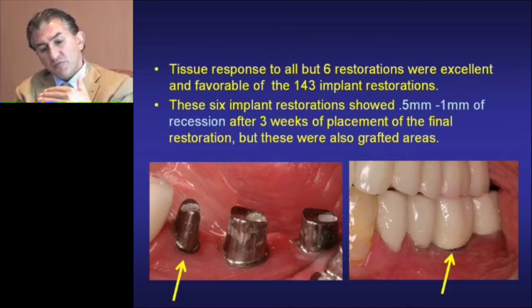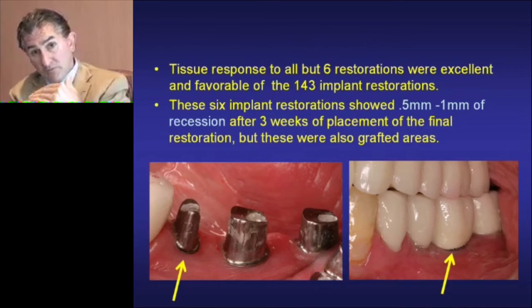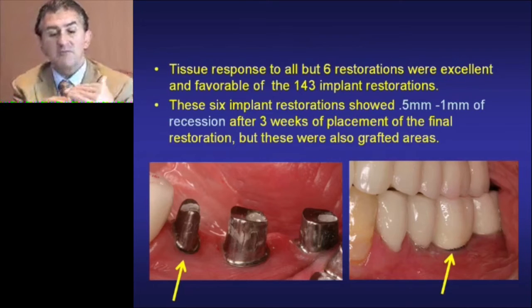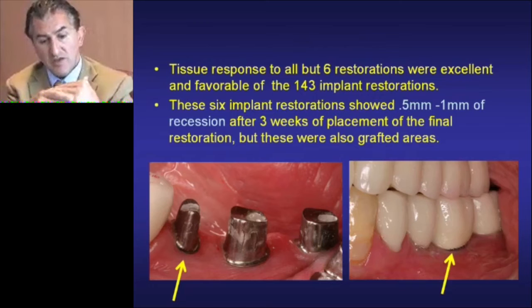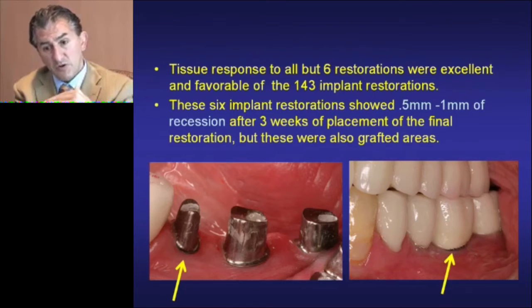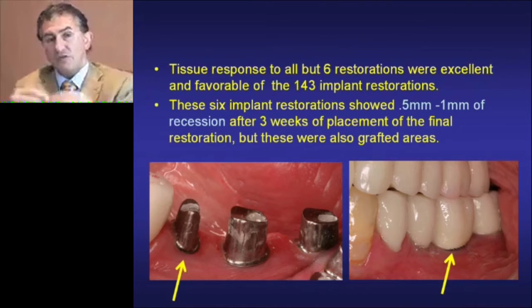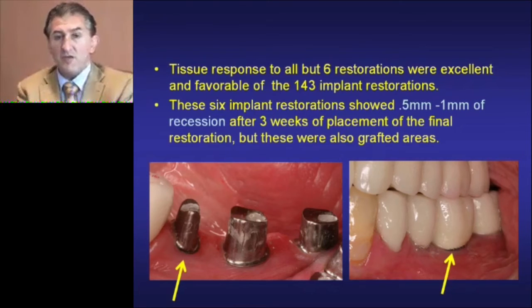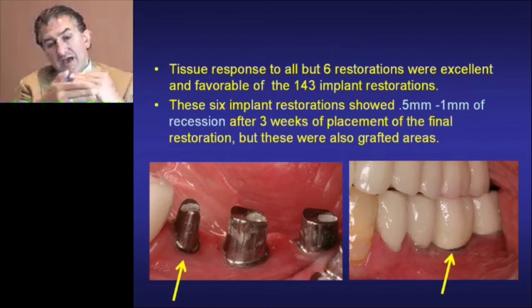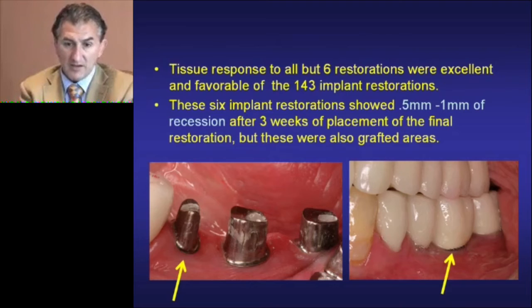Another problem was we were not asking the laboratory to make the abutment at 1 millimeter below the tissue. We were asking them to make it at the tissue. That conversely led to when we placed the abutment, the tissue would roll over and we started getting the recession in the black line. Once we realized we had to specifically say 1 millimeter below the tissue, as the tissue was pushed, there was enough compensation that we stopped getting that line, and that since that time we haven't had that problem.